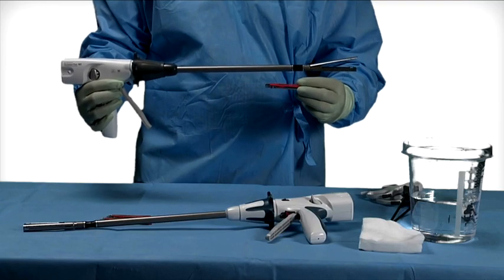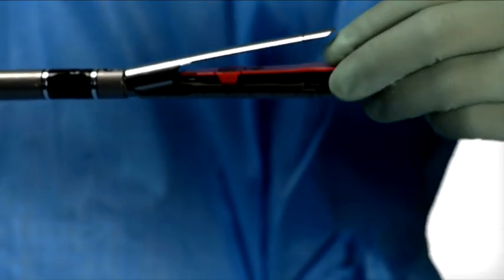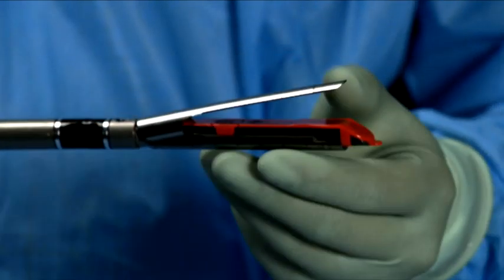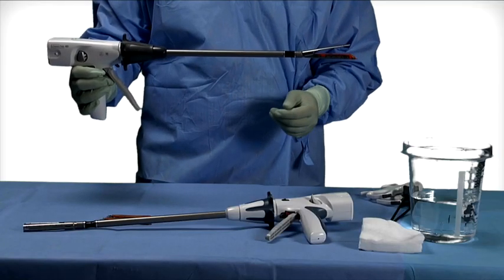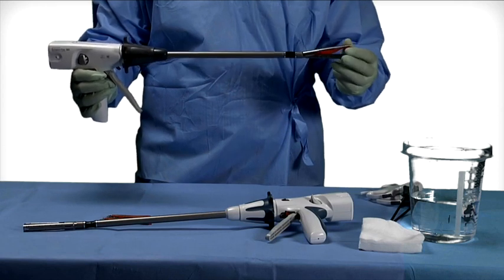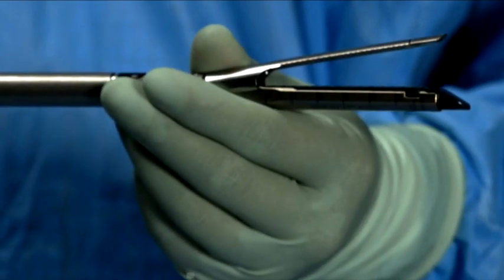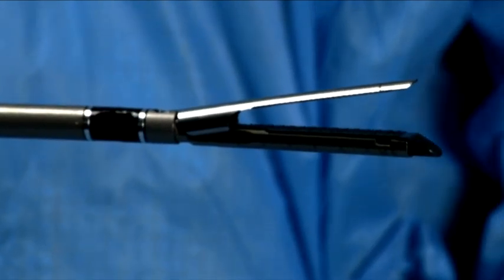After ensuring the staple retaining cap is present, insert the reload by sliding it against the bottom of the reload jaw until the reload alignment tab stops in the reload alignment slot of the jaw. Snap the reload securely in place. Remove the staple retaining cap by lifting it straight up and discard. Observe the surface of the new reload to ensure that no colored drivers are visible and the reload lies flat in the jaw channel.